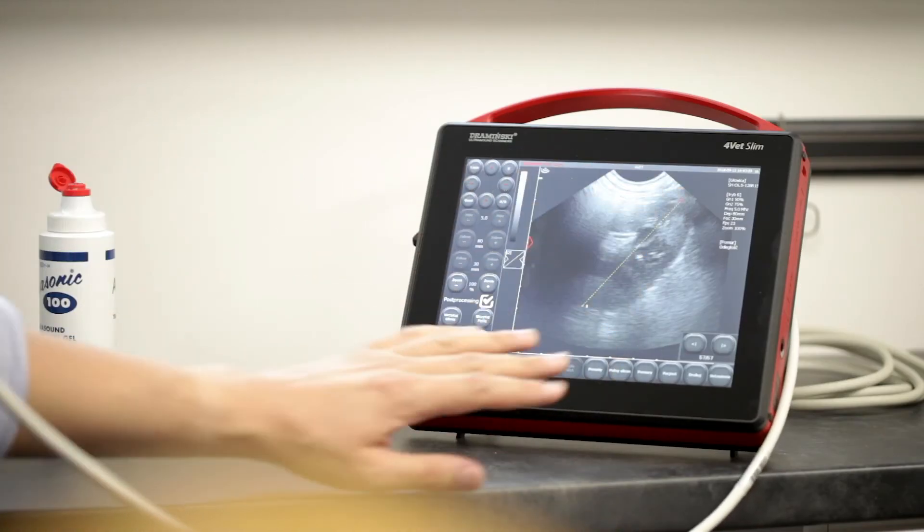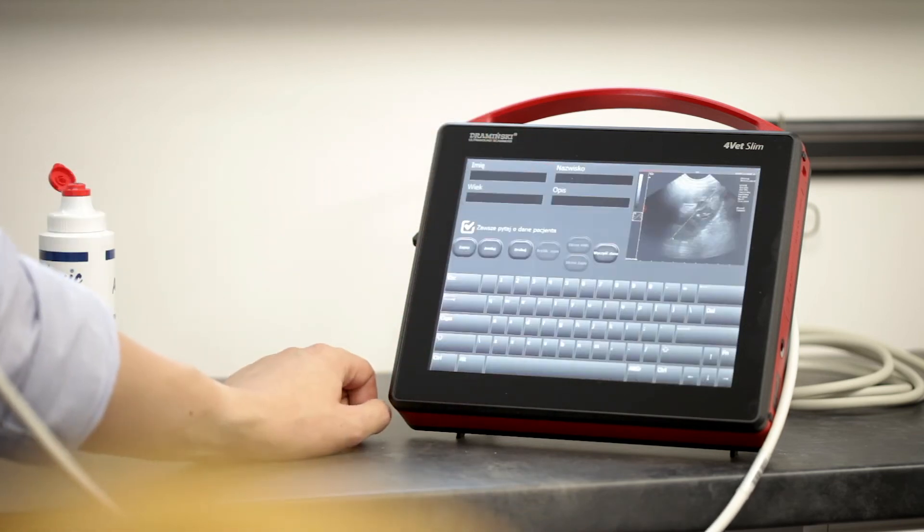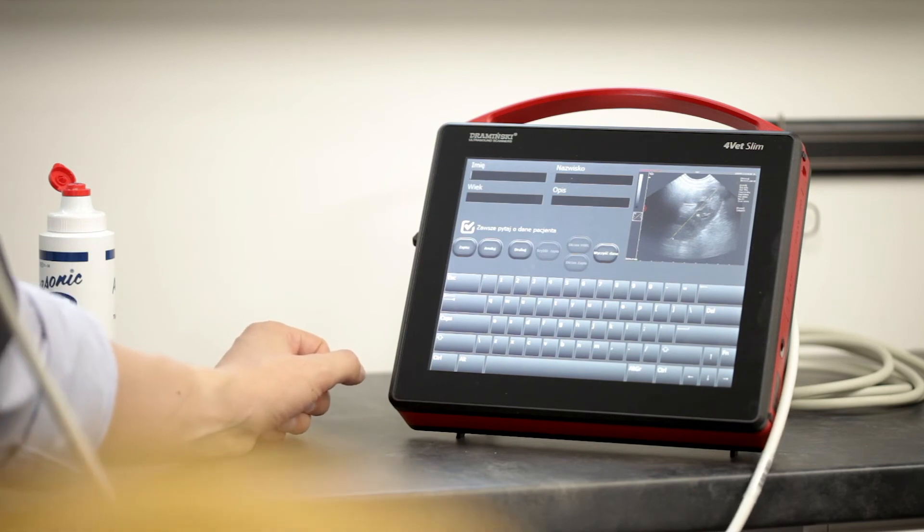To save the image with the measurement, we just tap freeze, then measure, then save image. We can put in some details of our patient and that's it.